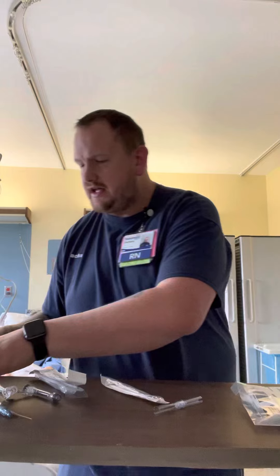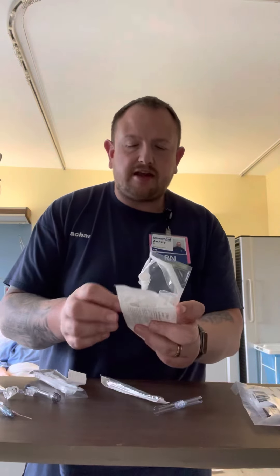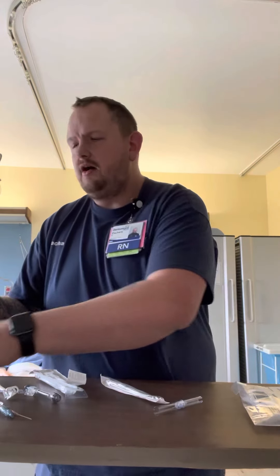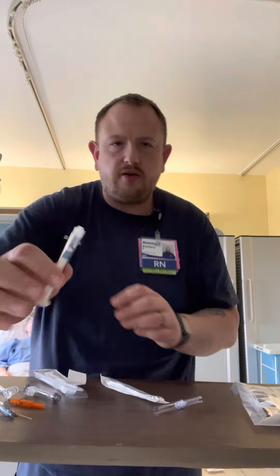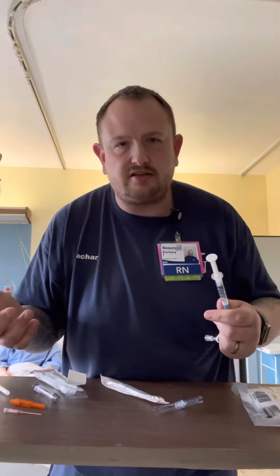If you remember the old kits, they're actually located in the Clean Utility Room. They come in a pretty bulky package — band-aid, prep, orange needle — and if you open it up, you're going to notice a small little wafer. There's a luer lock, so we were able to hook these up to our lock and pull off our venous blood gases pretty easily.